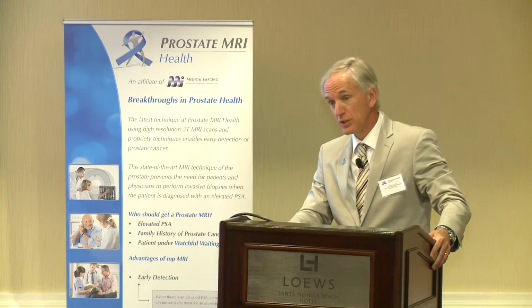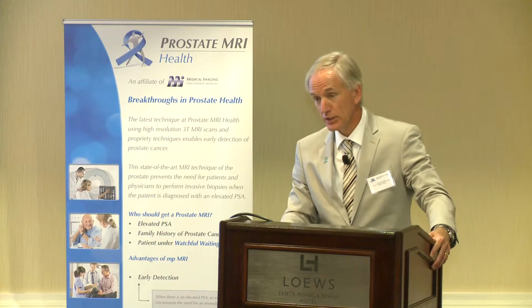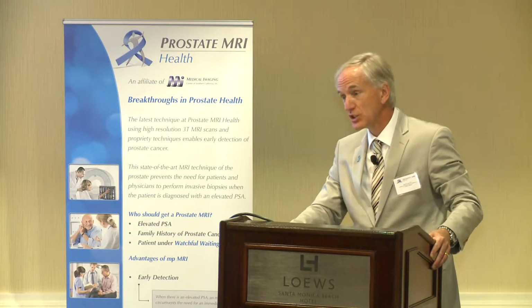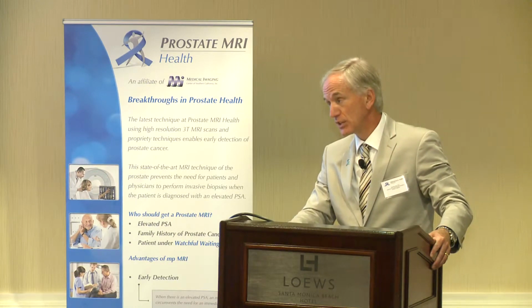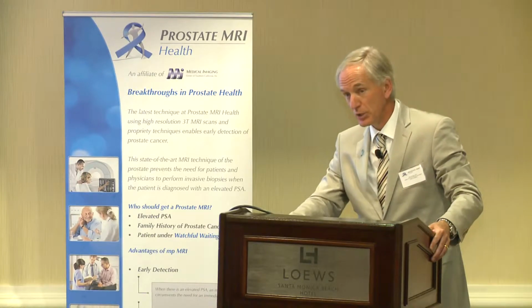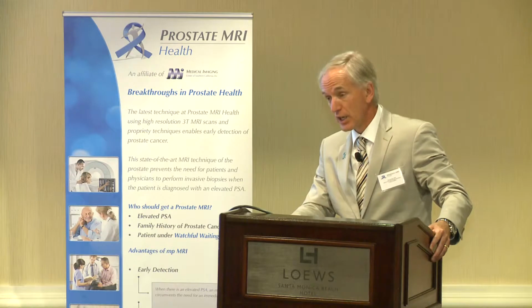The second question about the tumor: does volume matter? I know that now perhaps I'm just cursing in the church in front of a urologist. I think volume is less important than aggression. Having said that, we have difficulties in detecting 3+3, that means a non-aggressive tumor. Even big ones we can completely miss. The question is, is that really bad? The other thing is we really are good at showing highly aggressive tumors.